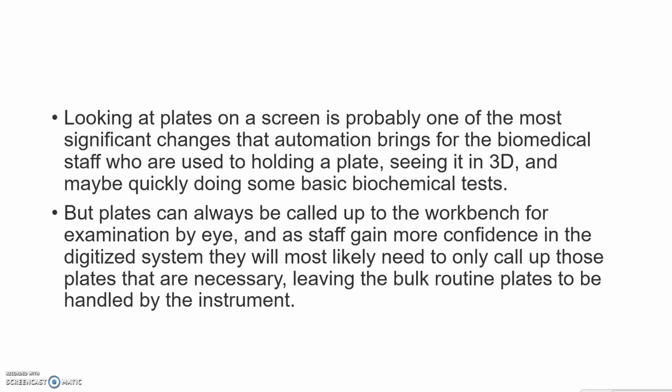Looking at plates on a screen is probably one of the most significant changes that automation brings for the biomedical staff who are used to holding a plate, seeing it in 3D and maybe quickly doing some basic biochemical test. But plates can always be called up to the workbench for examination by eye, and as staff gain more confidence in the digitalized system, they will most likely need to only call up those plates that are necessary, leaving the bulk routine plates to be handled by the instrument.